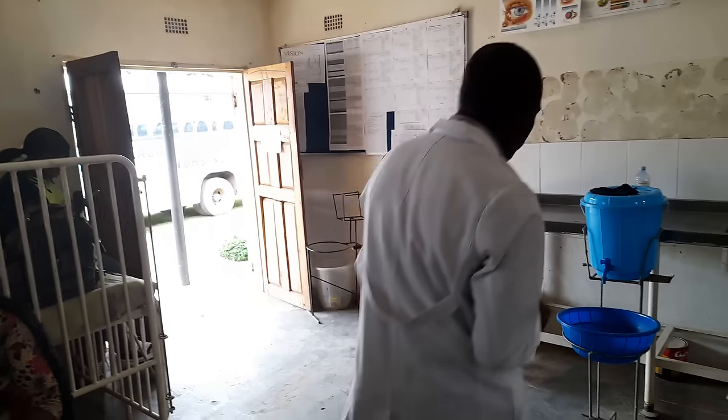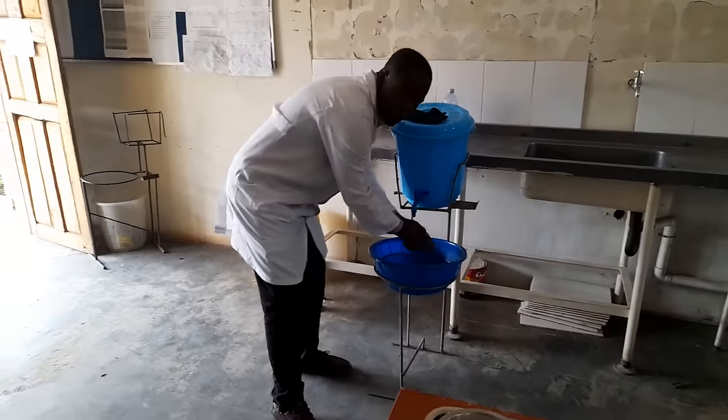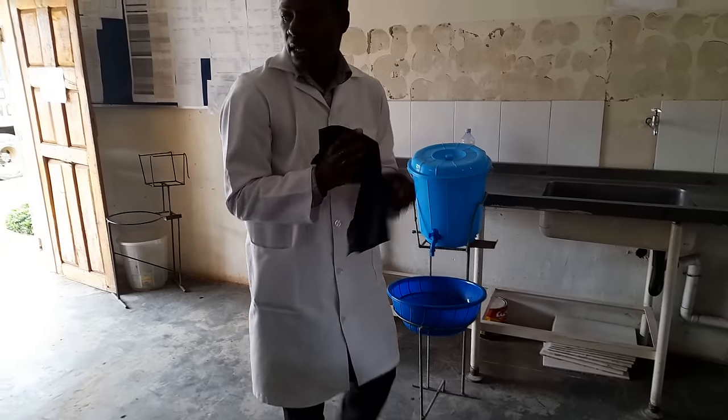The last part is to do hand washing again. Wash your hands with soap, then dry your hands. Thank you very much, and keep practicing. I know it's challenging to use a mercury sphygmomanometer, but keep practicing. Thank you.